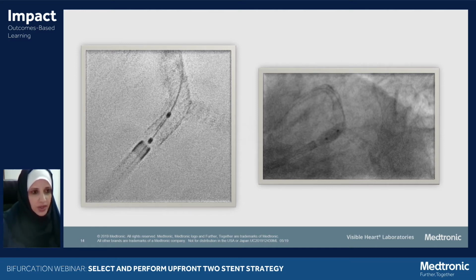So you want to be at the ostium of the stent. You want to determine where your carina is, where the stent in the circumflex takes off. You want to position your balloon, which is a non-compliant balloon. And usually one thing that I've learned over time, and I don't know if all labs have all supplies, but before you start a procedure like this, just make sure you have all the lengths that you need. So if this is a 4.5 balloon, which it was a 4.5 balloon for the proximal optimization, make sure you have the 4.5 by 8.